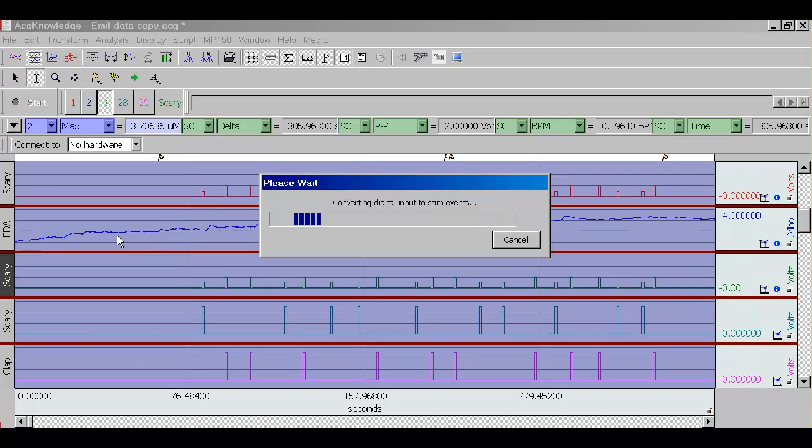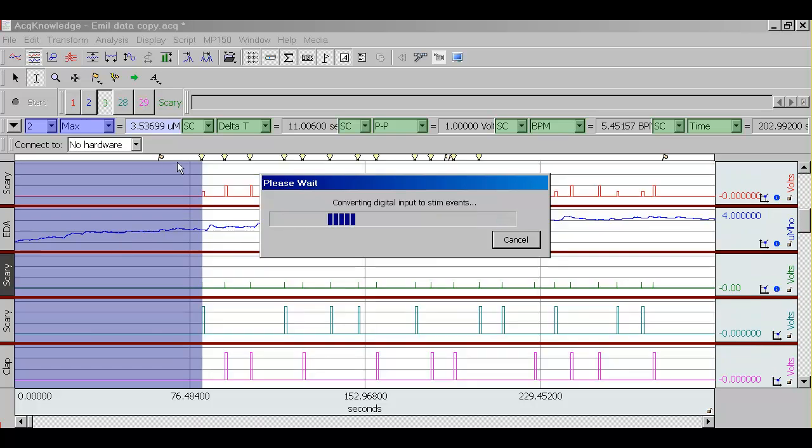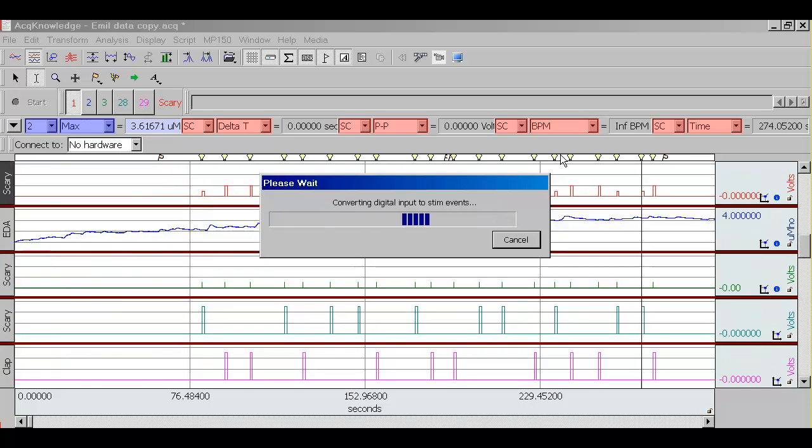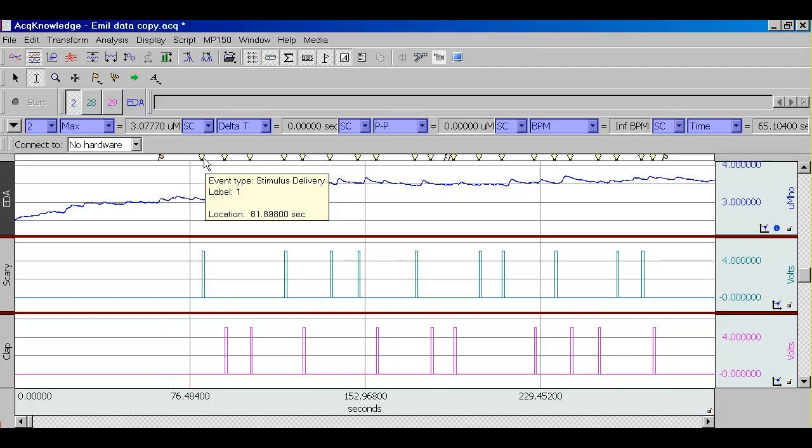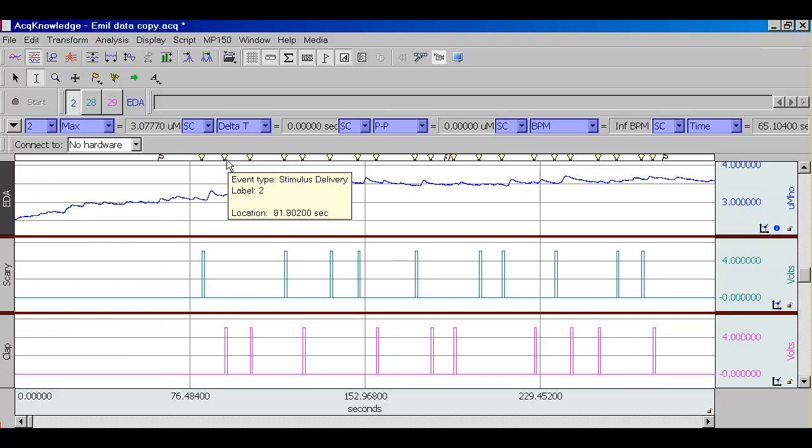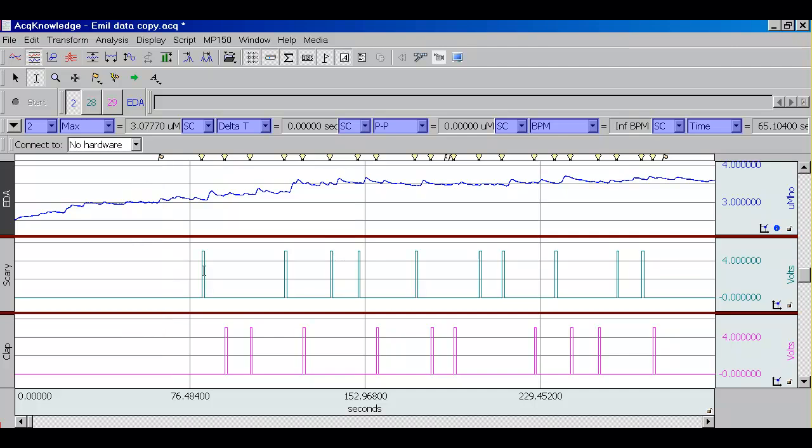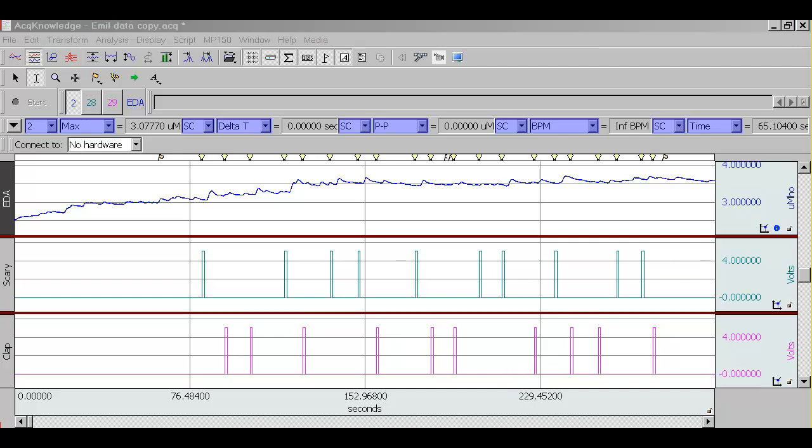You will see now, up here, where global markers are placed, these light bulbs called stimulation event markers will appear. Each of them has a label. This one has a label 1, and this one has a label 2. As you can see, they correspond to the first and the second channel of stimulation data, respectively.